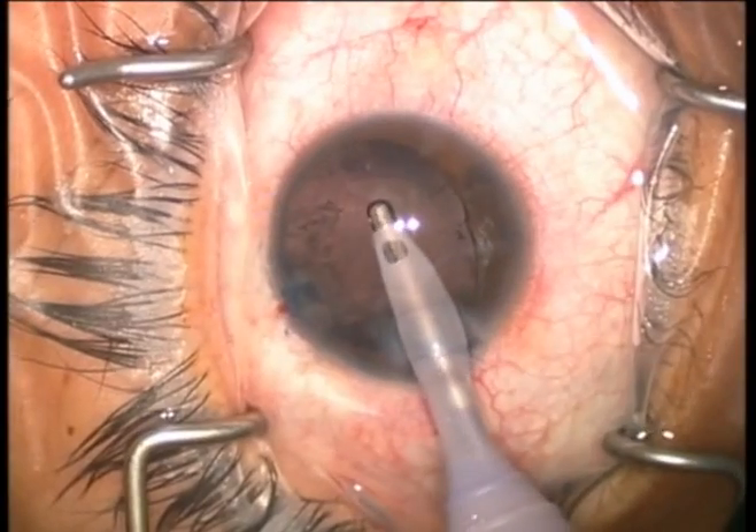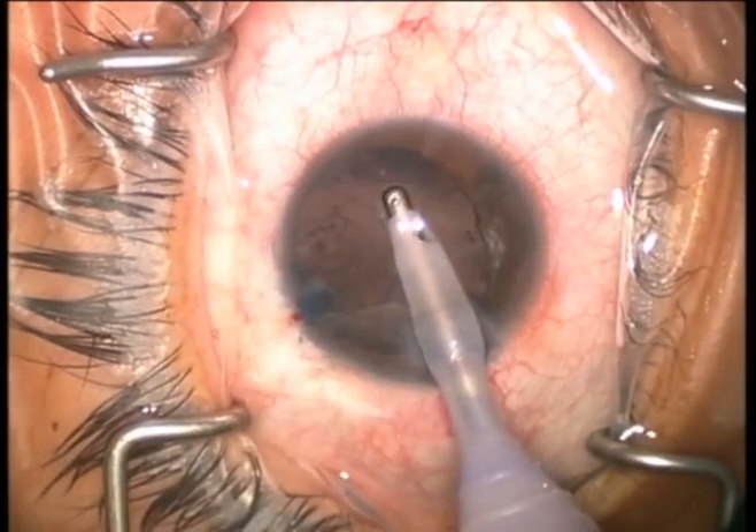We'll now go ahead and complete the lens cortex removal and we can proceed with the case as normal.